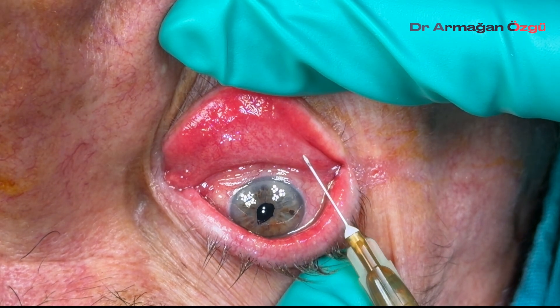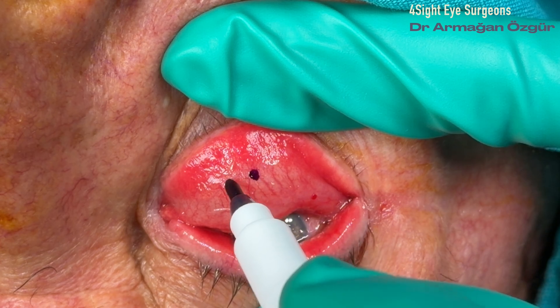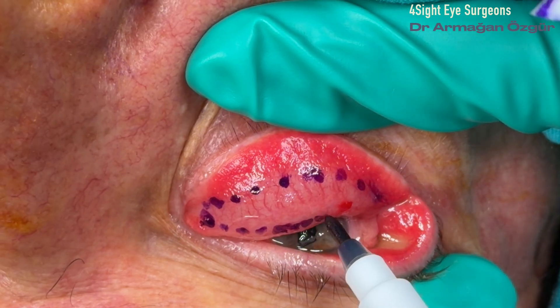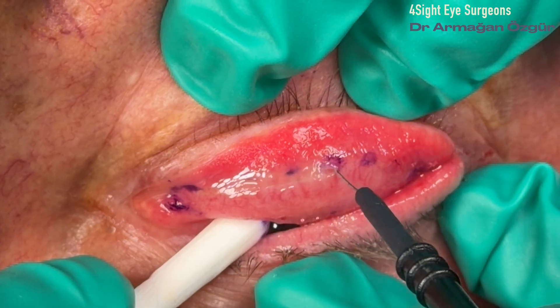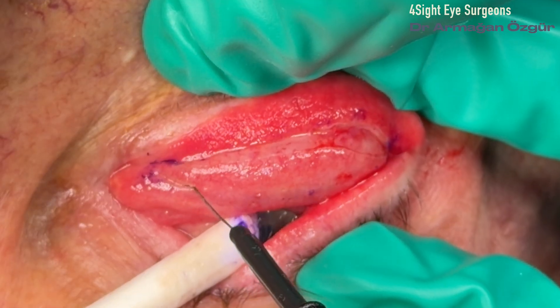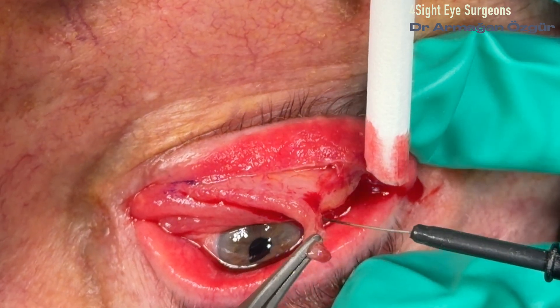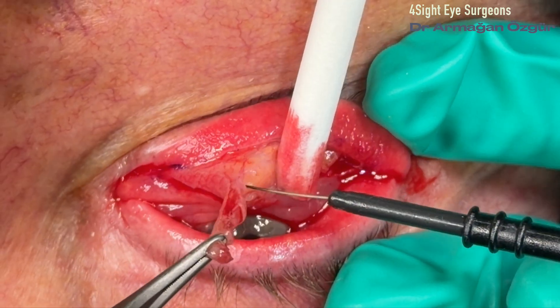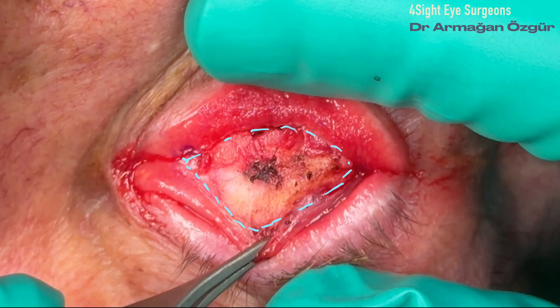Fortunately, my friend Kübra Ceylanoğlu assisted me in this case. A 4–5 mm ellipse of conjunctiva is outlined just below the inferior tarsus border, extending from the lateral canthus to the punctum. Care is taken to avoid injury to the tarsal plate and the inferior punctum during excision.